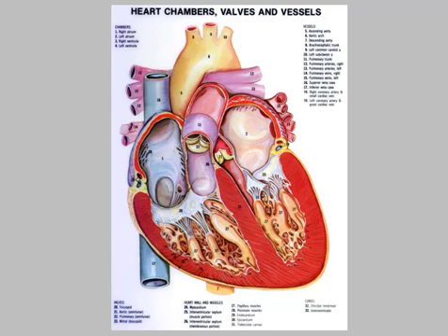This is that nice drawing of the heart you've seen before. I've chosen it again because it illustrates very nicely the anatomy we'll be discussing in this presentation. The catheter is inserted via the vena cava, either the superior or the inferior vena cava. It crosses the tricuspid valve into the right ventricle, and then it's twisted so that it crosses into the right ventricular outflow tract, across the pulmonary valve and into the pulmonary artery along one of its more distal branches. And you all know those anatomical landmarks.